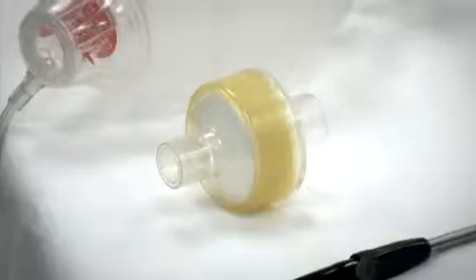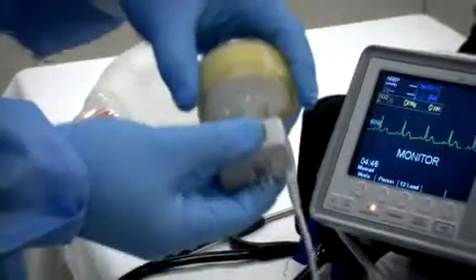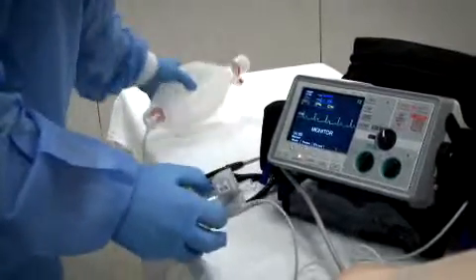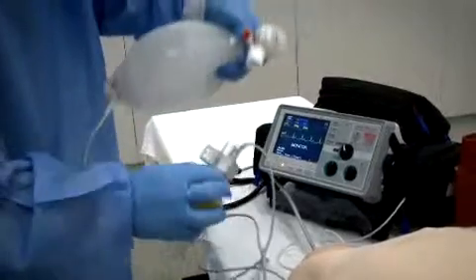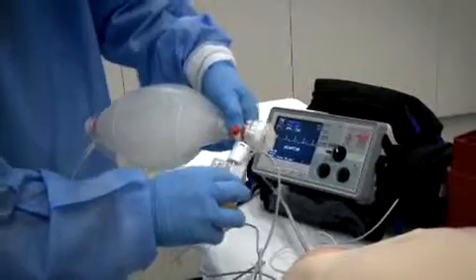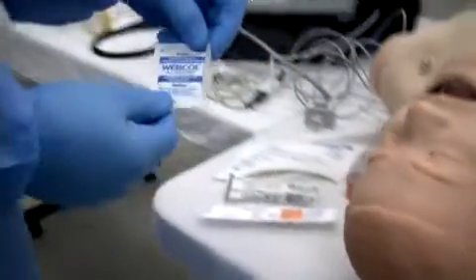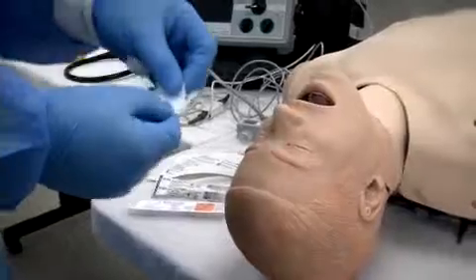Ensure that all monitoring equipment is in place on the patient. Attach the airway filter to the inferior aspect of the end-tidal CO2 adapter, and BVM will connect to the other side of the end-tidal CO2 adapter. Open and ready the alcohol swab, the catheter, and the 3 cc syringe.